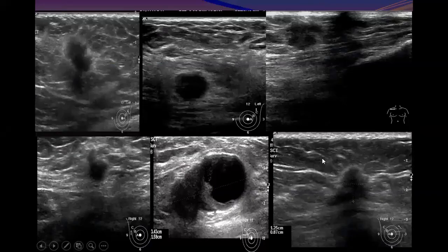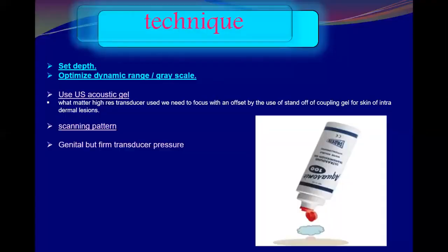So these all are my cases. You have seen, this is just below the clavicle, in the axilla, the axillary tail toward the axilla. Again, same in the axilla. This is at the mid-axillary line, same. And this is cancer in the extreme superior medial breast.